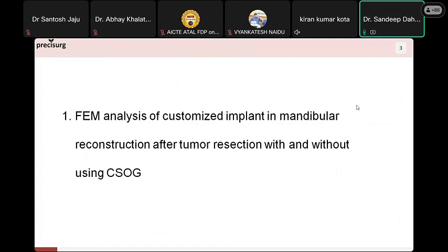So in case 1, because of the direct contact between implant and bone, that is zero gap, the fixation surface area increases over the same length. What happened in case 1 is that the fixation surface area is maximum as compared to the other cases.